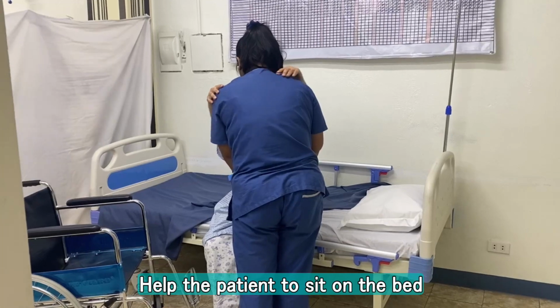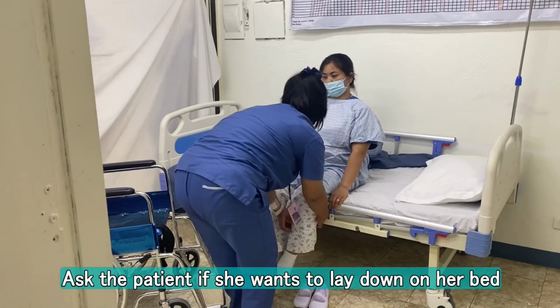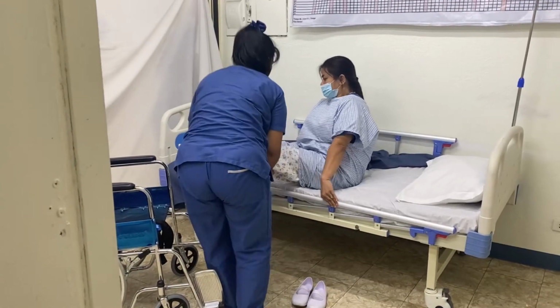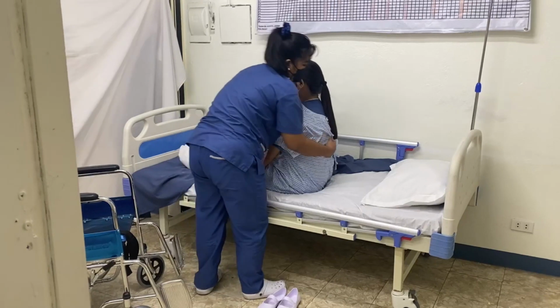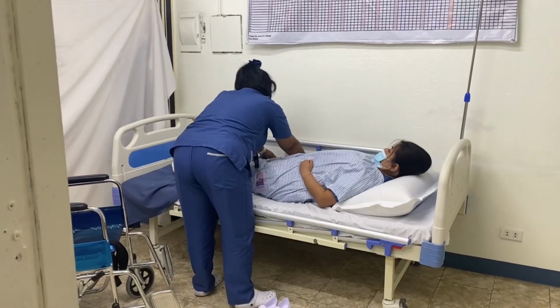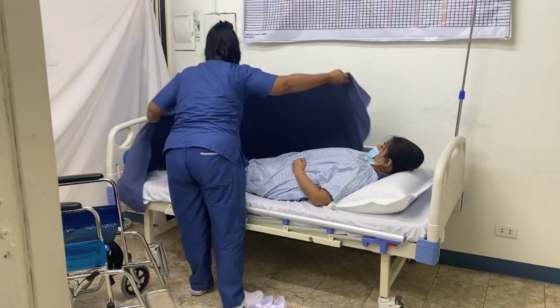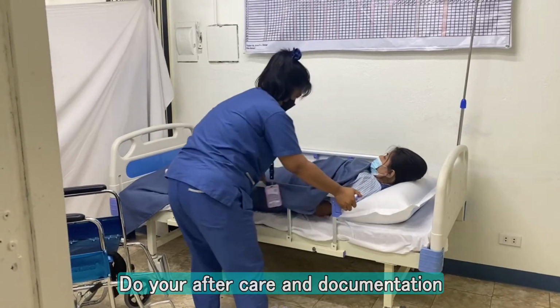Help the patient to sit on the bed. Ask the patient if she wants to lay down on her bed. Do your aftercare and documentation.